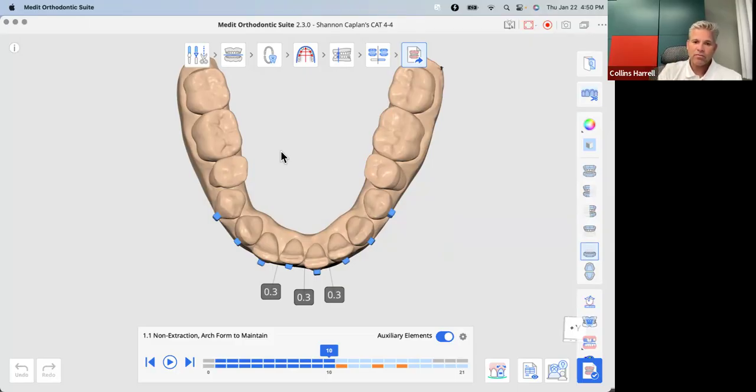So think of your aligners, instead of everything in one set of aligners, go, I'm going to order my leveling and aligning, just get everything opened up. Then I'll go in and refine the tooth anatomy and do my IPR, take another scan, and I'll take that next set, which is try to get the teeth as close as I can to the final position. And then I'll have one more final phase where I go in and just detail out all of the results that I got from my previous two sets.